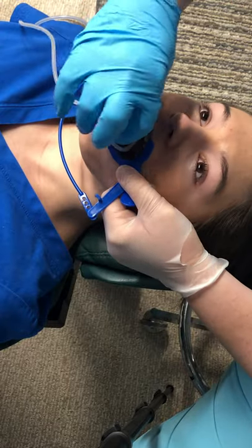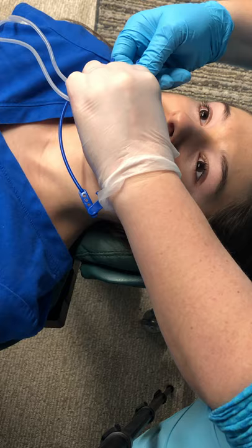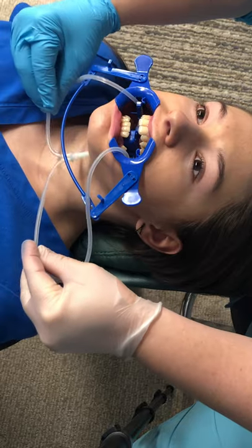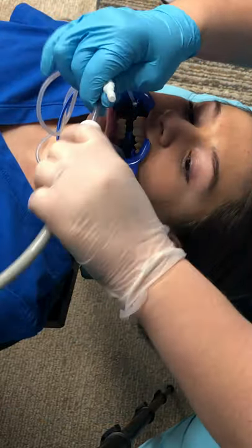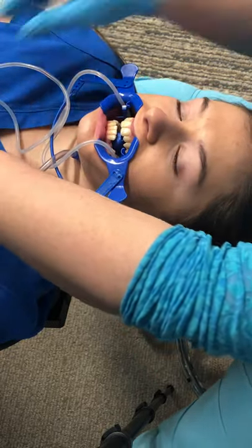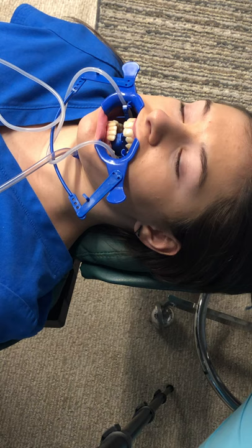Open a little bit — sometimes it's hard to get them in there. Now we're going to connect this to the suction. So instead of having the saliva ejector hanging off of her, we're going to have it automatically connected right here. You hear it suctioning?